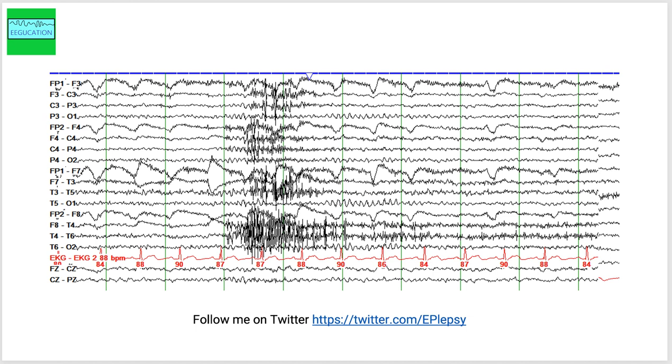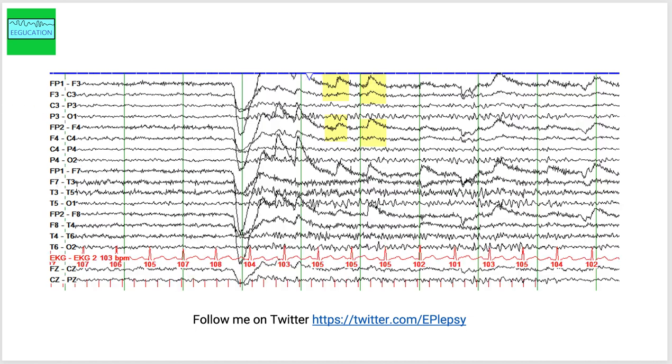This whole artifact, this is a muscle artifact, swallowing artifact most likely. So you see muscle artifact in multiple channels which most likely is swallowing artifact. What you see here, these are eye blink artifacts. Okay, let's move on to the next page here.